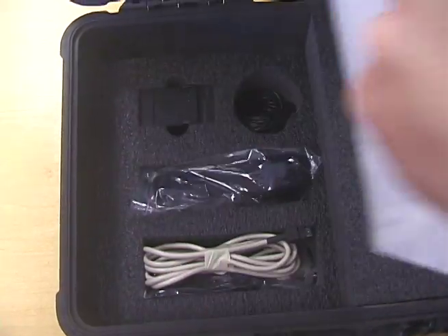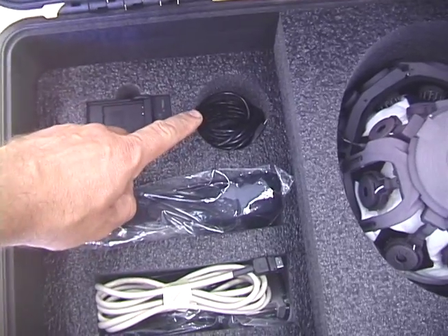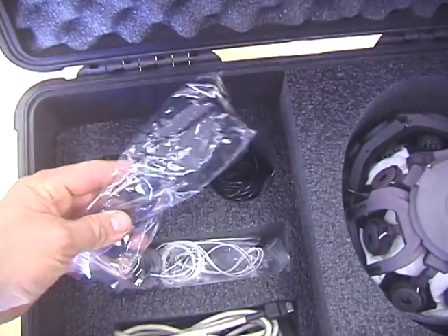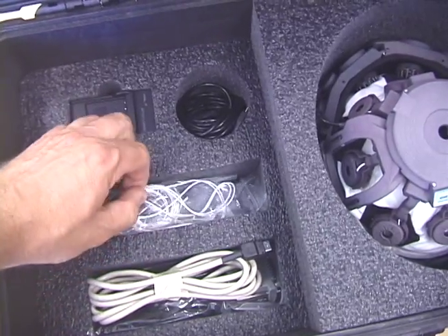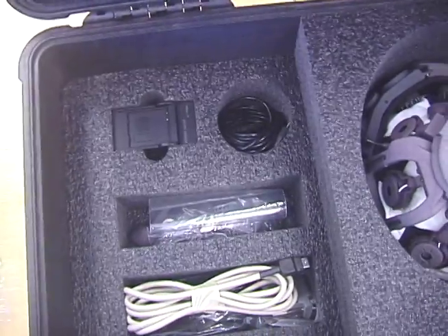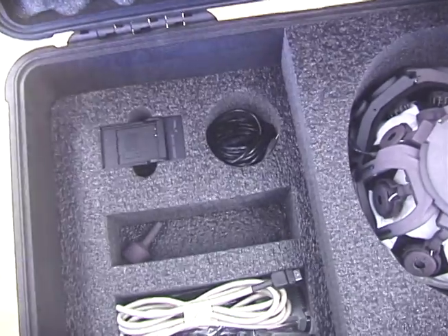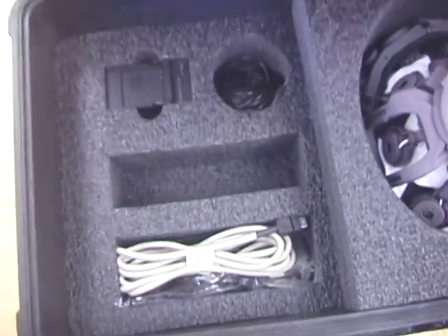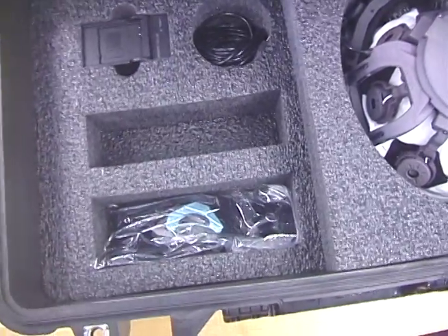Beneath the manuals for the software and the headset you will find a battery charger, a cable for wired operation should you choose not to use Bluetooth, and straps to hold on ECG or EMG sensors. This pair of sensors can be used to measure either ECG or EMG. You will also find spare EEG electrodes and a spare adjustment tool. Finally, there is a trigger cable and extra padding for the headset.